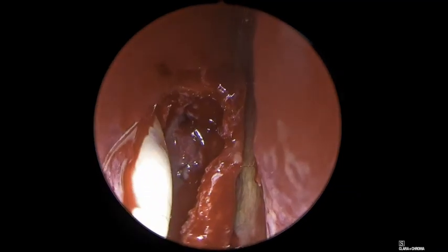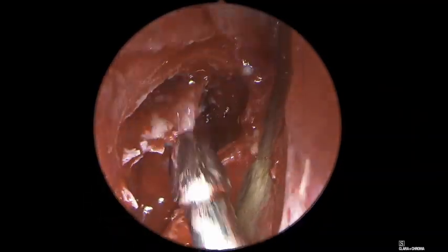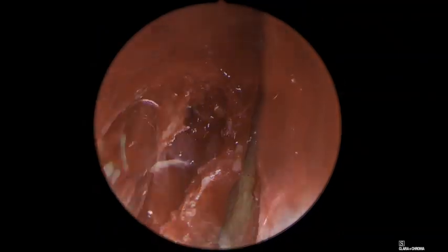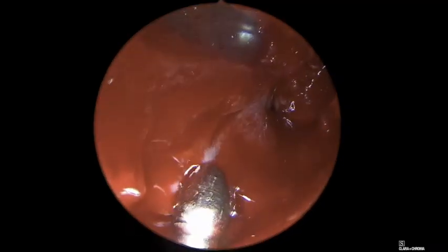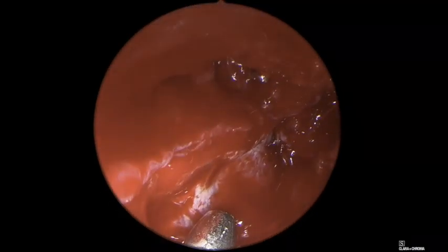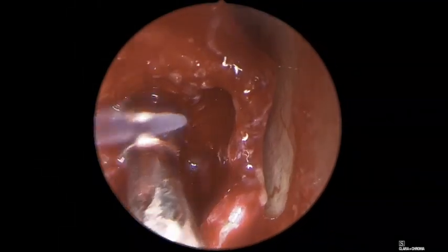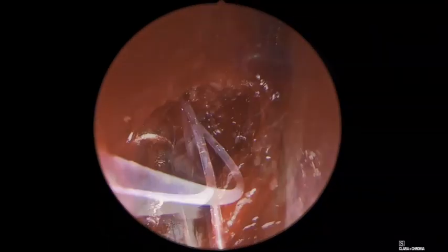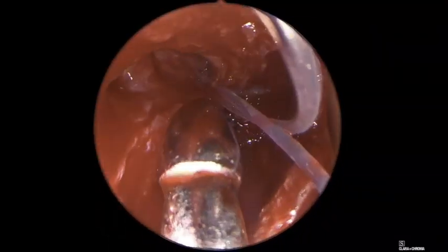Lacrimal mucoceles should be drained in this step. To reduce the risk of postoperative scarring obliteration, it is paramount that the lacrimal stoma be as wide as possible. In this way, sometimes it is possible to identify the lacrimal canaliculi. Finally, a bicanalicular silicone stent is inserted through the stoma and left in place until the local healing has been achieved, at least 3 weeks after surgery.